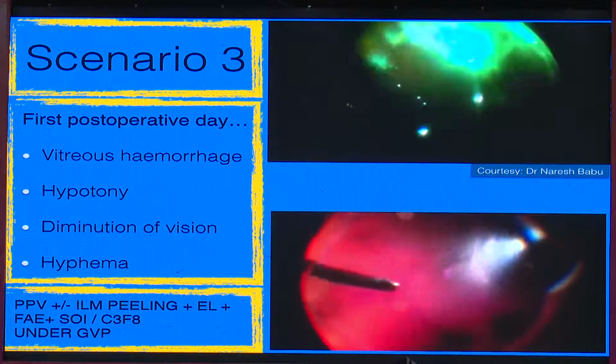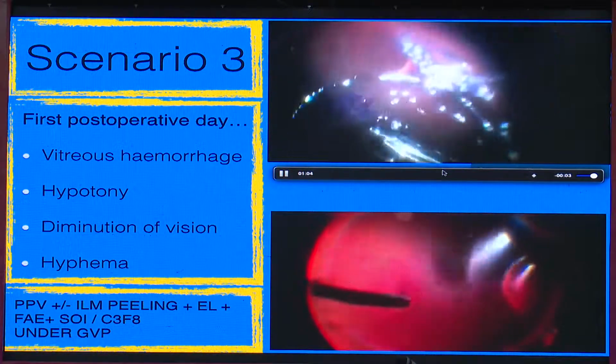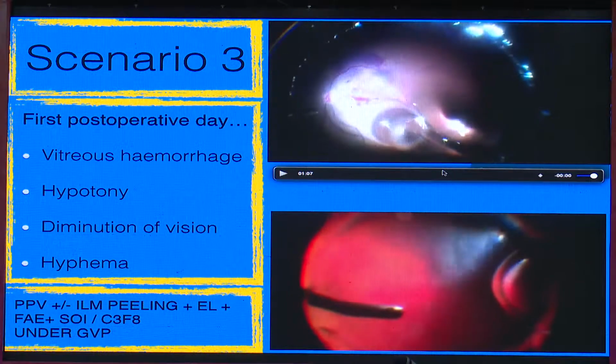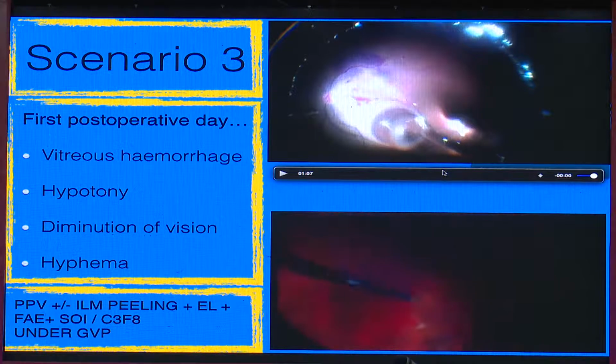Another case, again a vitreous hemorrhage. There were multiple perforations in this particular case. There was an SICS where they had also done a bridle suture. So there was a perforation related to the bridle as well as multiple perforations because of repeated injections. Just clearing the PRH over there, and then this was the first break.